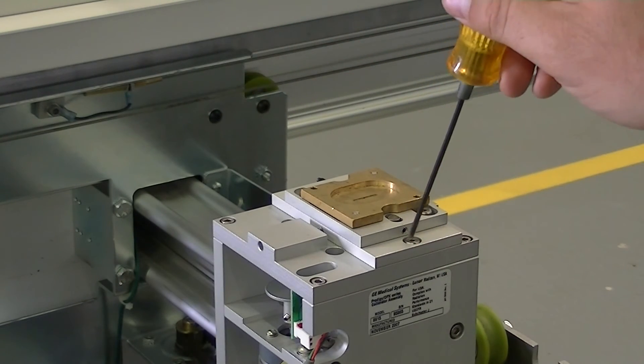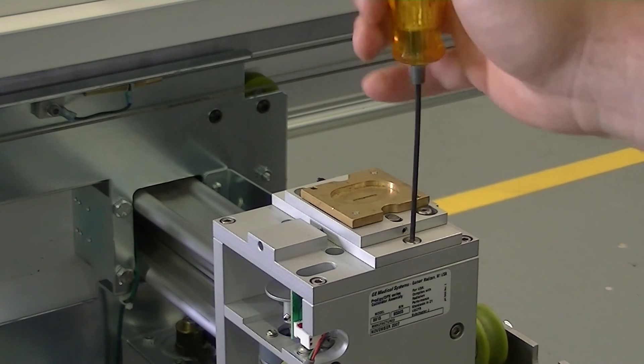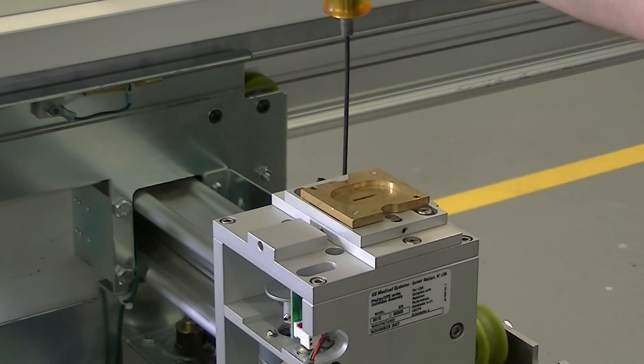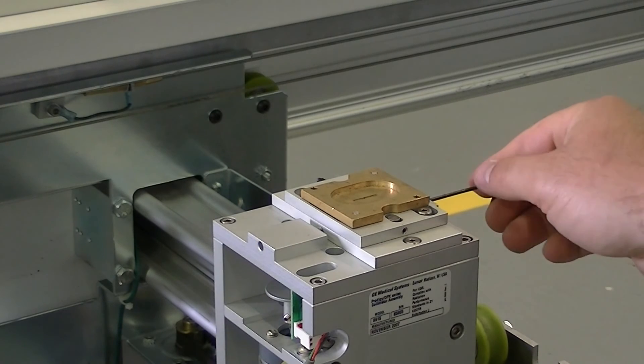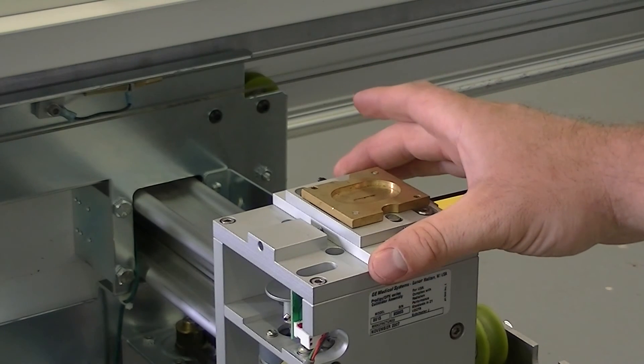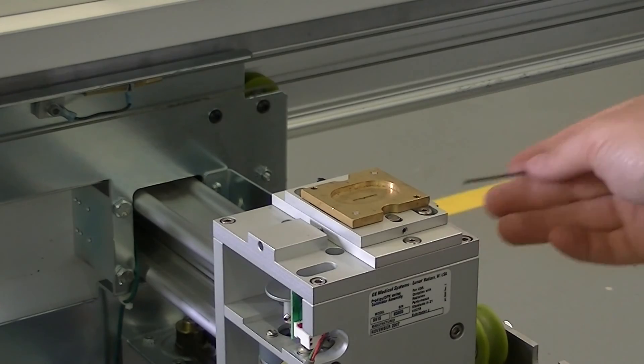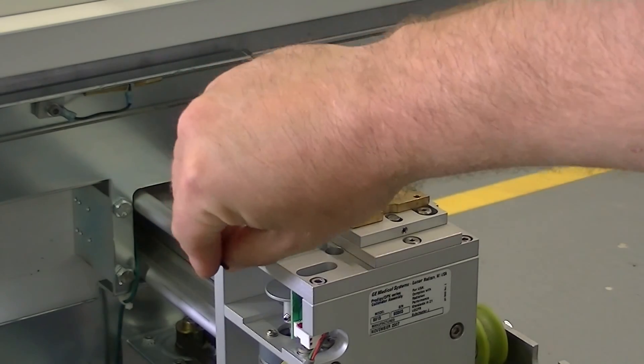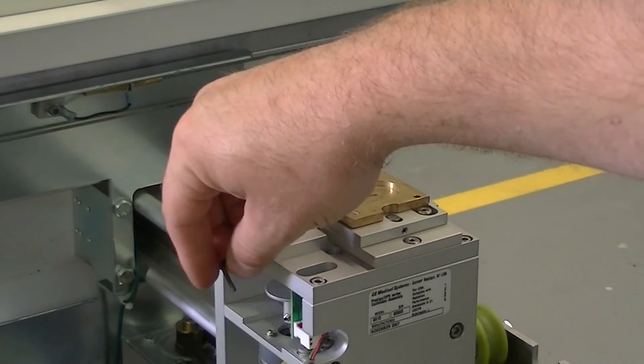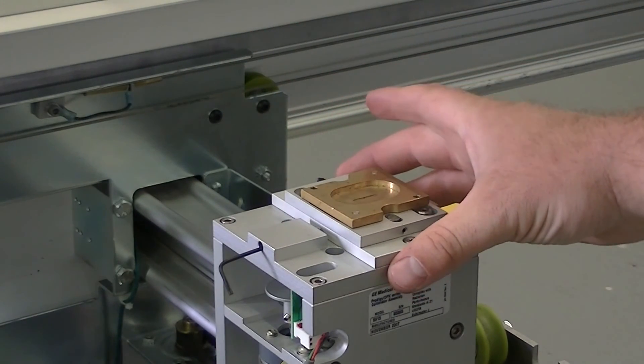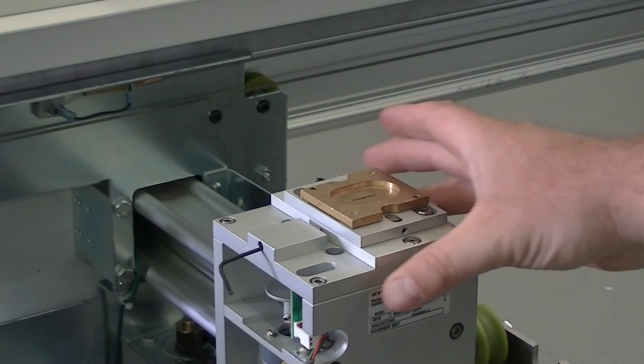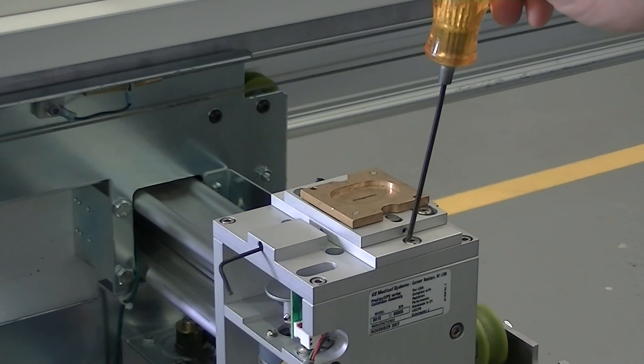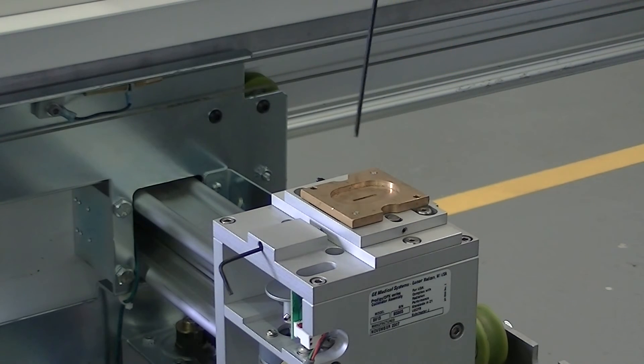The next slots that we need to adjust is the bottom one. We're going to loosen that. This will allow us to adjust from side to side, and secure this down as well.